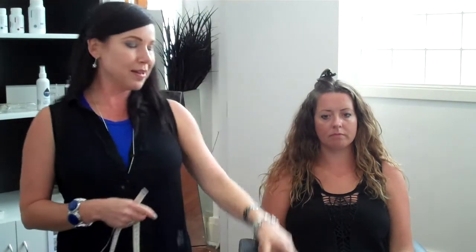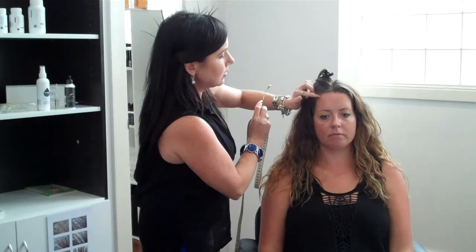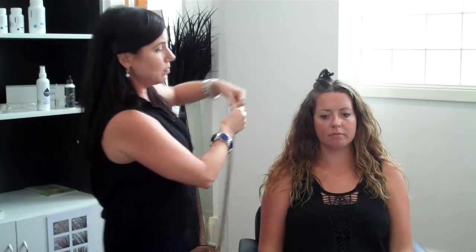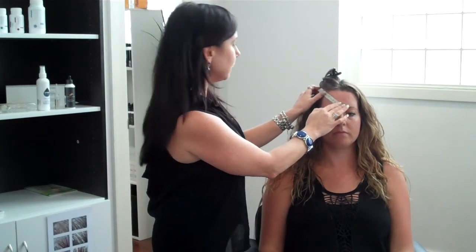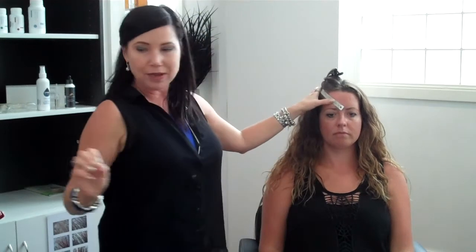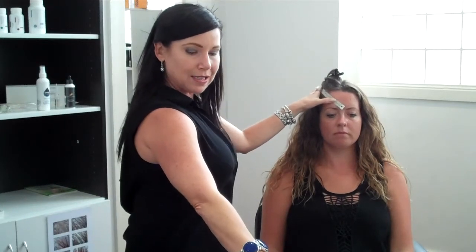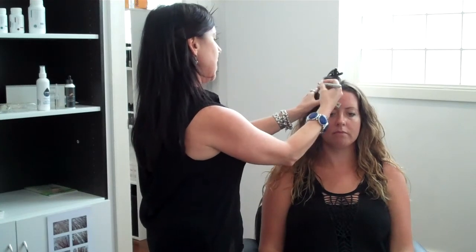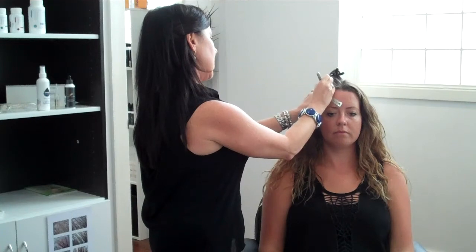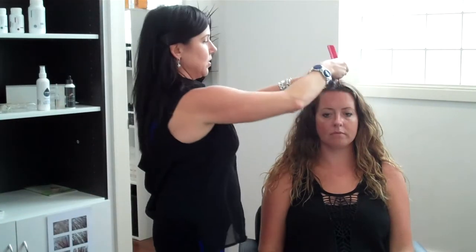Last time we measured five centimetres across from the part, so we go in and measure and know that our line is in the exact same place. I always measure from the bridge of the nose because, unless you have surgery, the nose won't move. So you know you're in the same spot. We read our locations from last time, which were seven, eight, nine, ten and eleven, with the last one being dermis. We mark seven, eight, nine, ten and eleven. I've also written down that I went to the right of the mark, so I go to that side only to get the most accurate picture.